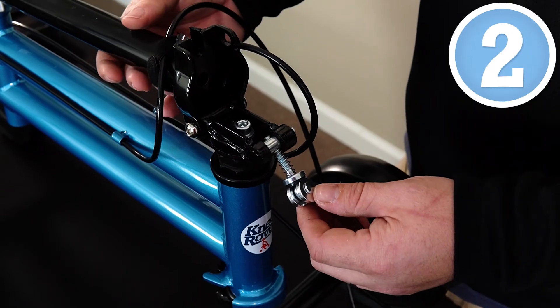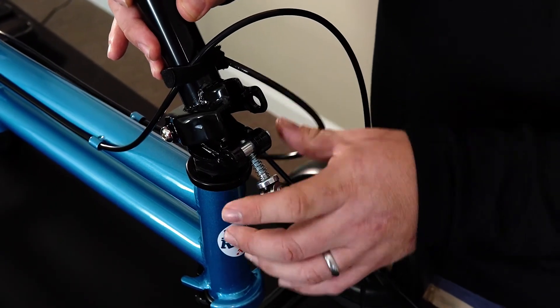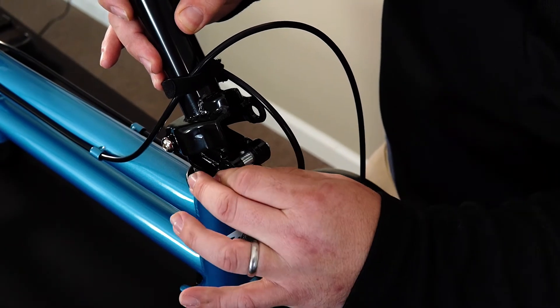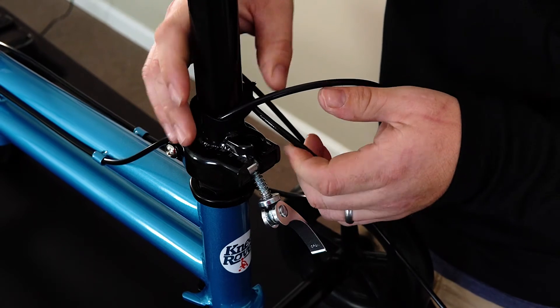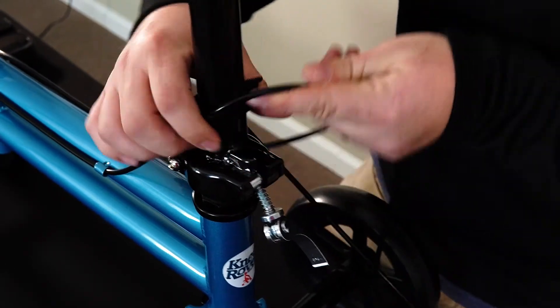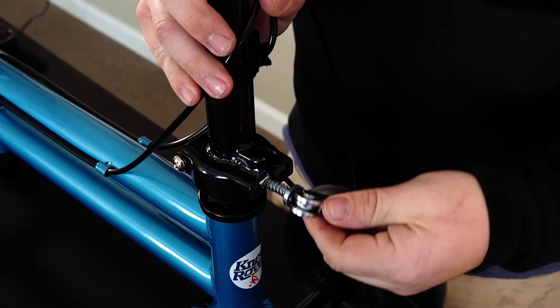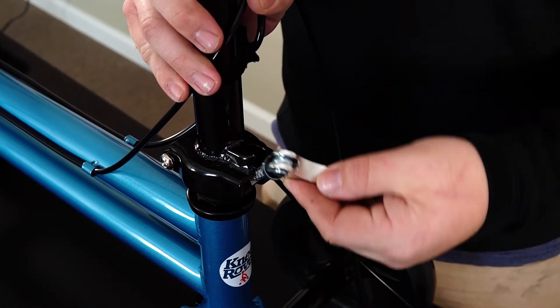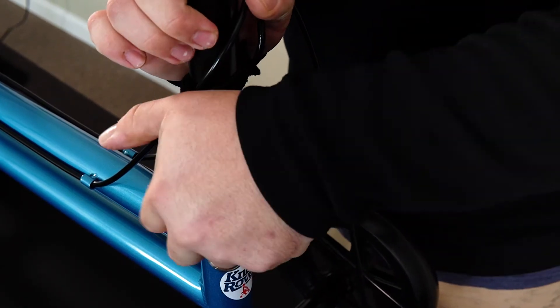Step two, we're going to secure the steering collar. In order to do this, we're going to rotate this upwards and take this quick release lever and pull it over, drop it down and release it. You may have to rotate these cables upwards like this — hold them. Then take this quick release lever, pull it up into the groove and clamp it down.